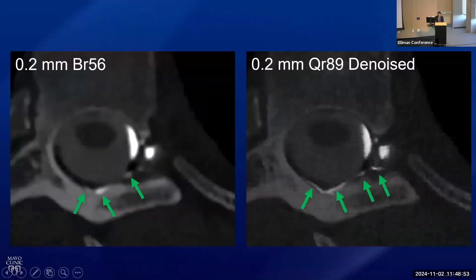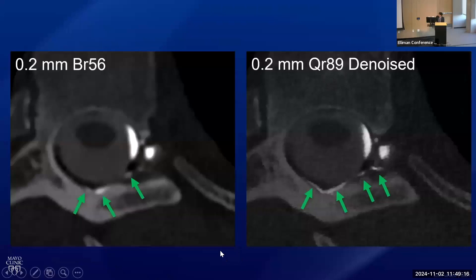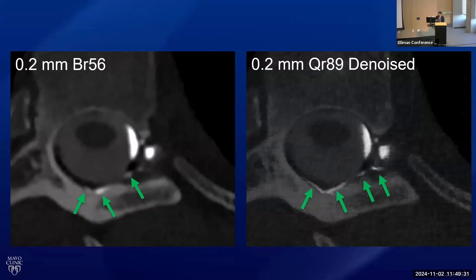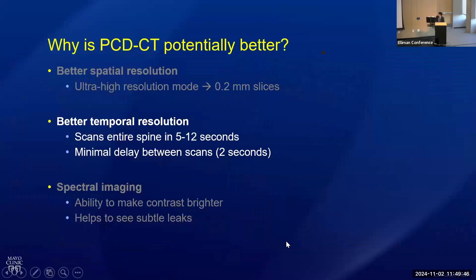Spatial resolution isn't all about slice thickness. These are both 0.2 millimeter images from another patient, but the way you reconstruct the image matters too. We use different imaging kernels that confer spatial resolution to the image. On the left is a smoother kernel reconstruction, and on the right is a sharper kernel. There's a vein here right next to the bone — it's really hard to make out on the smoother kernel, but on the sharper kernel it's much more obvious that there's a distinct vein compatible with a CSF venous fistula. It's harder to use sharper kernels on conventional CT scanners because the sharper the kernel, the more noisy and grainy the image becomes. The nice thing about photon counting CT is it mitigates the noise, so we can use these sharper kernels and really maximize our spatial resolution.